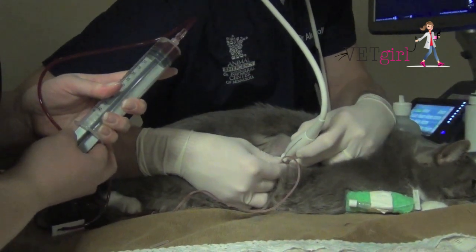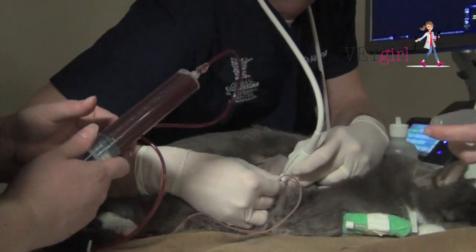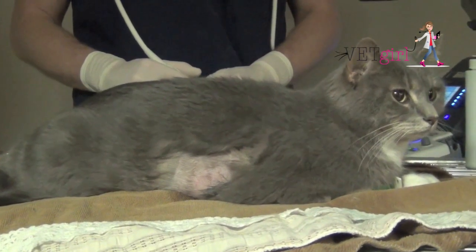Most of the time, we don't actually sedate cats for this because they seem to tolerate it relatively well. Clinically, you can see that this cat is dramatically improved — it's breathing much more comfortably and is no longer breathing with a short, shallow breathing pattern.